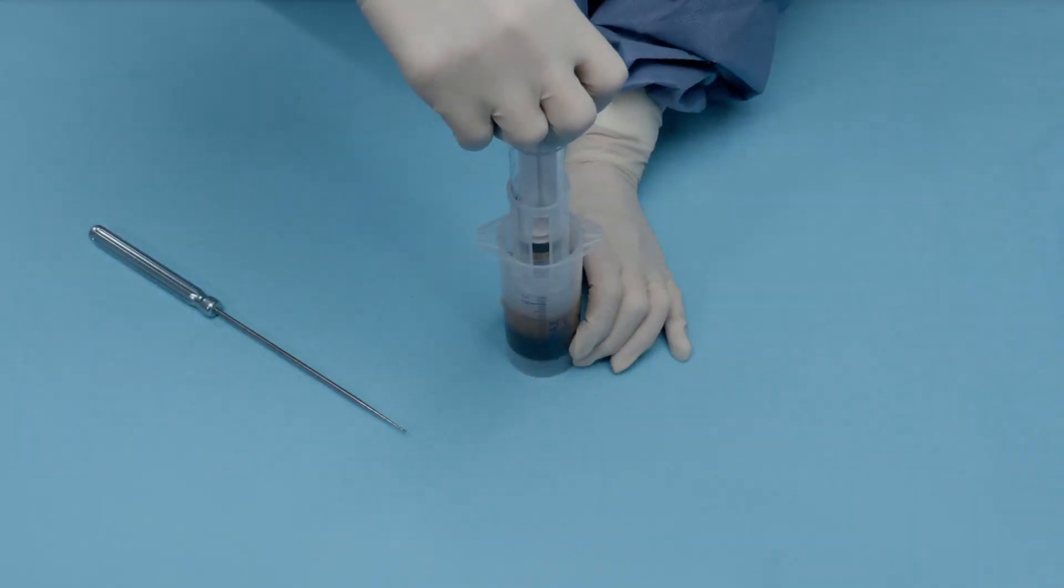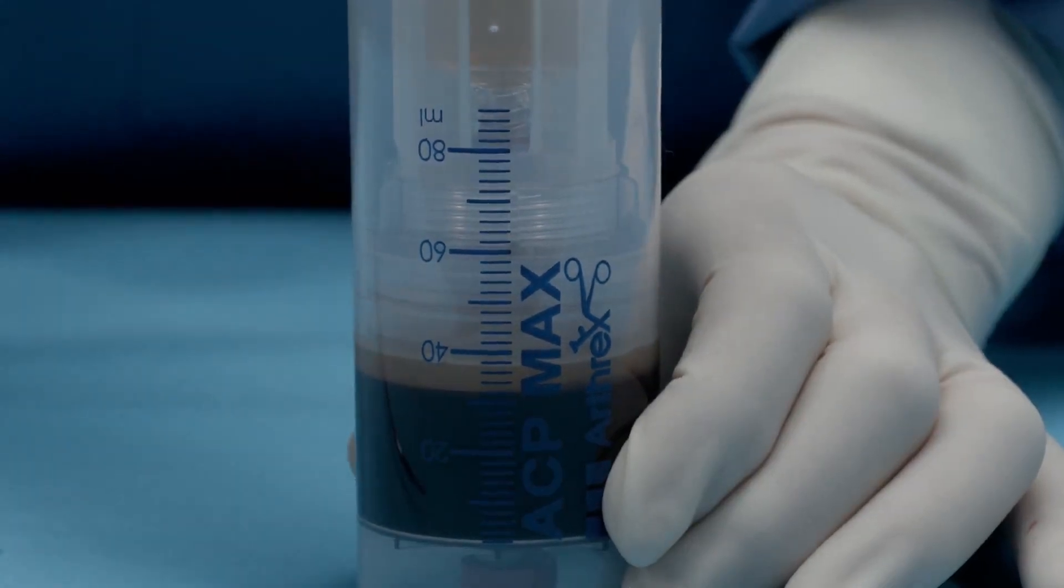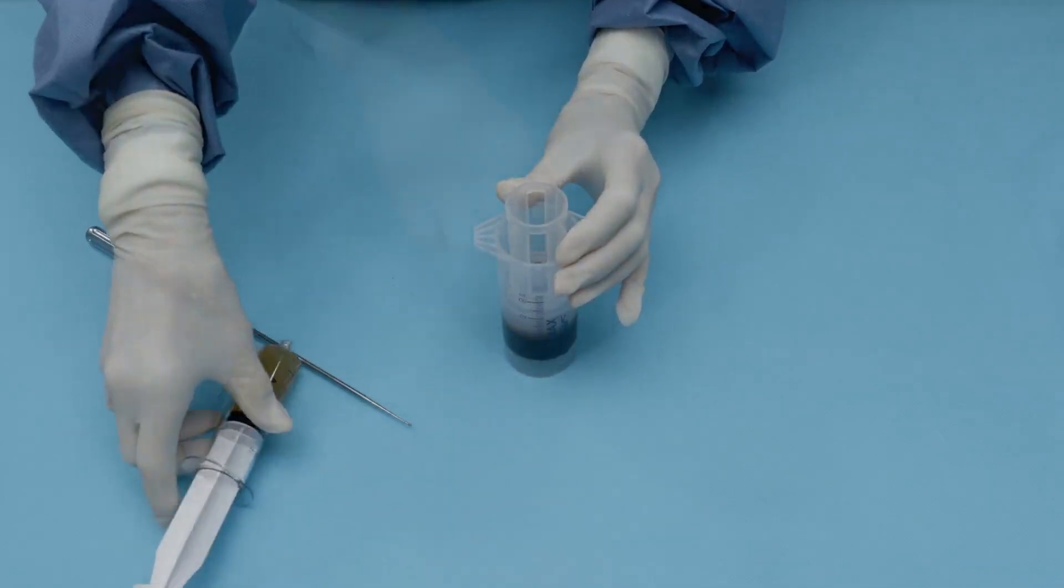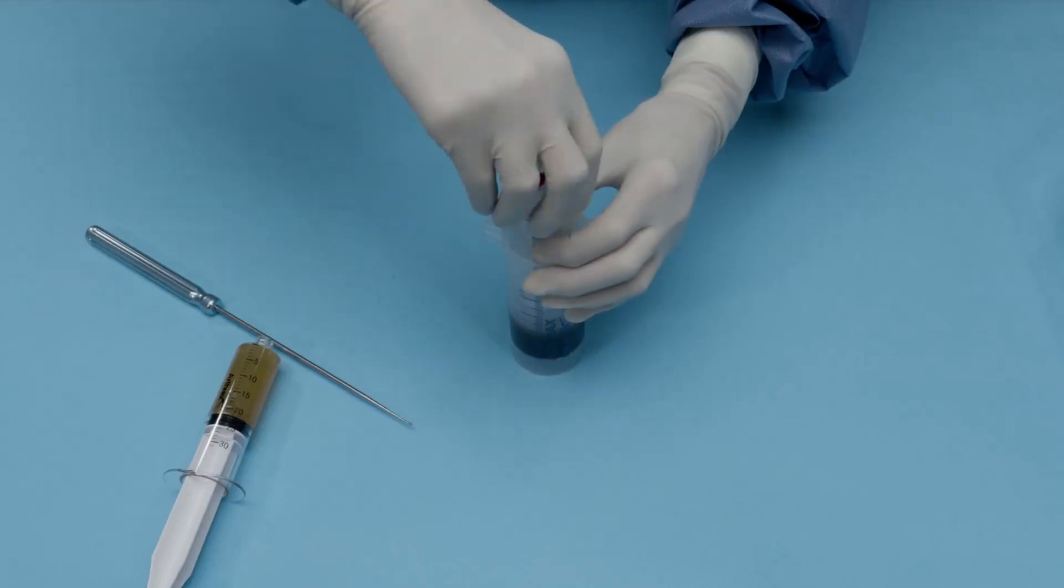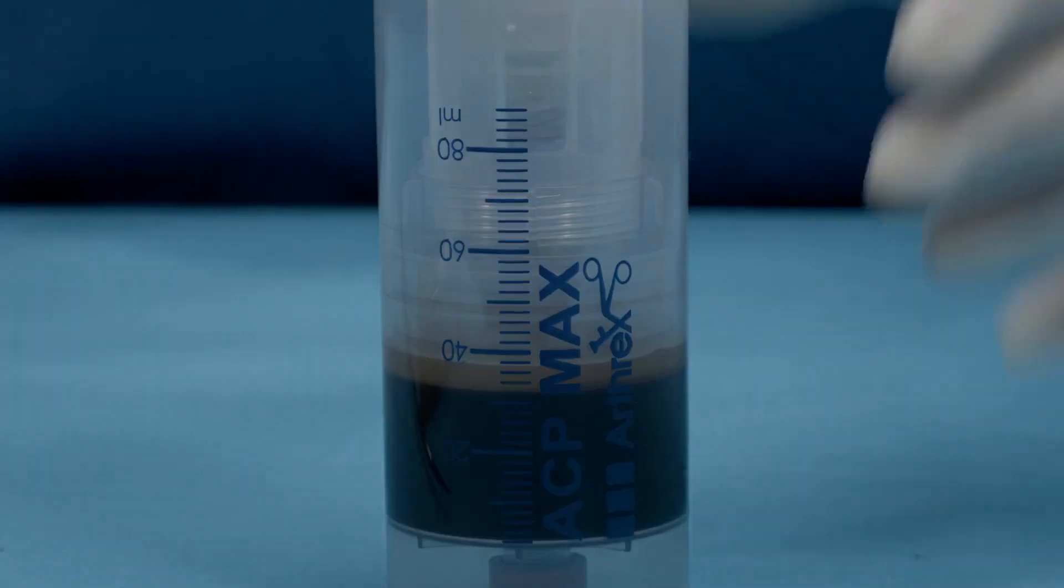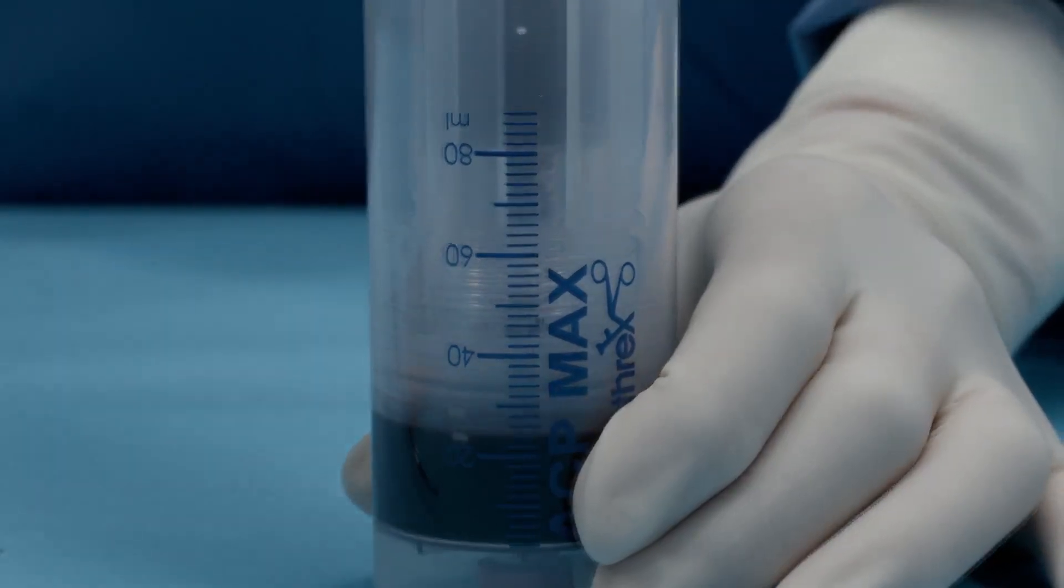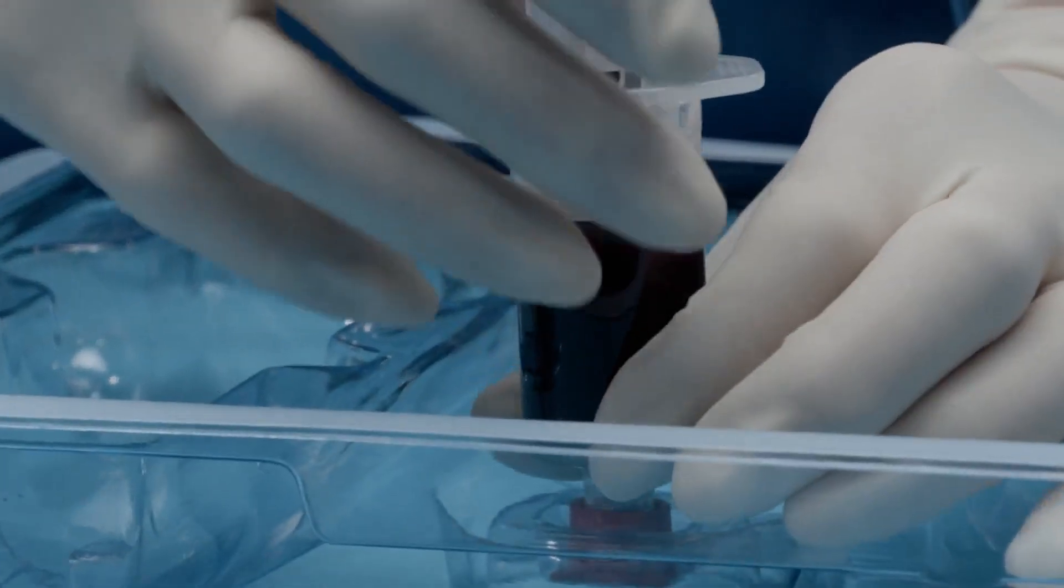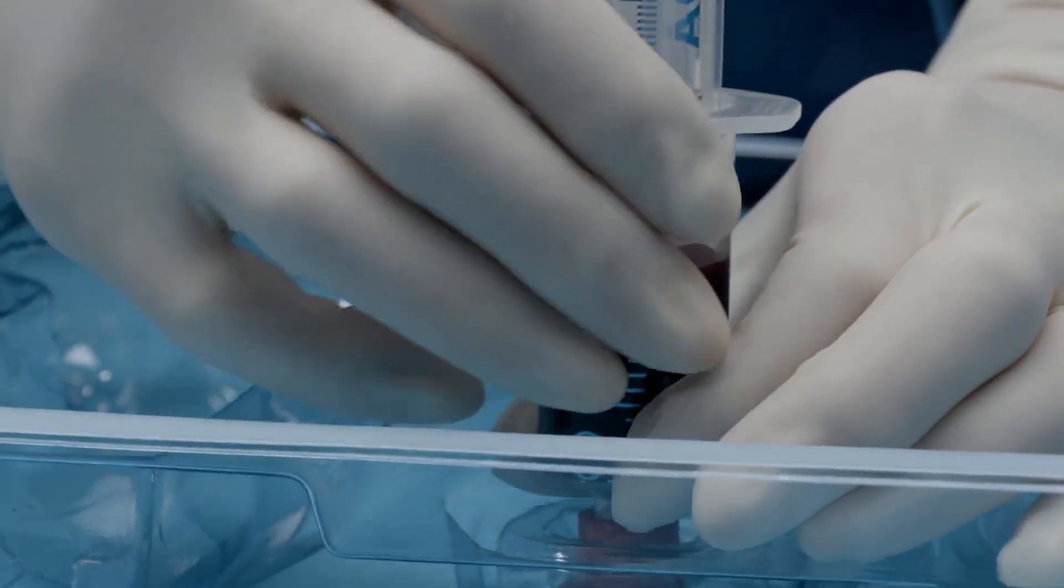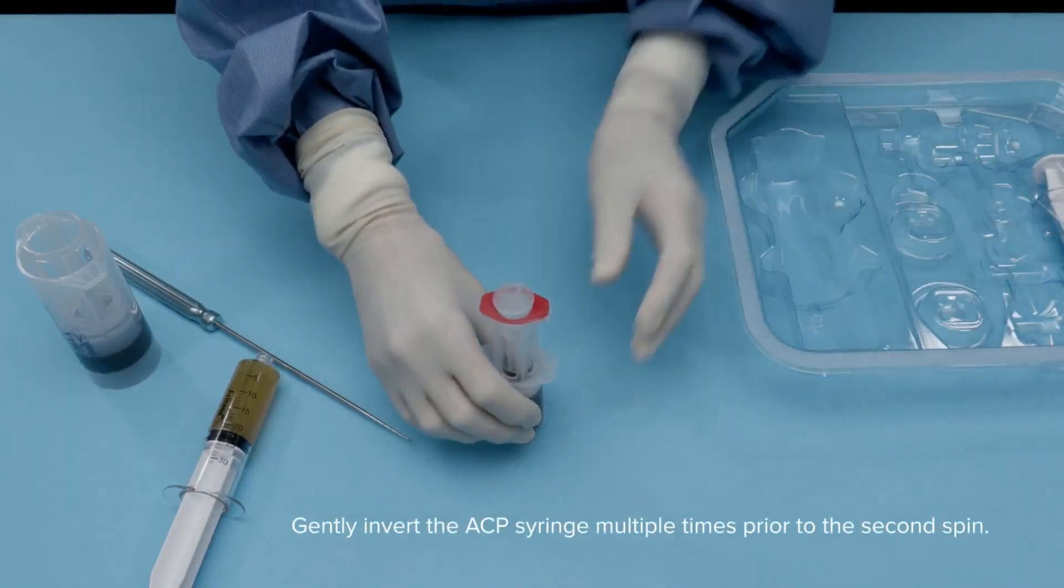We're going to pull off platelet poor plasma until we're at two ticks above the level of our Buffy coat. We then remove our platelet poor plasma, and we place our double barrel ACP syringe onto the needleless lure valve, and we withdraw 15 cc's of product. We then remove the Buffy coat product, and we place the lure cap onto the product. And now we're ready for our second spin.